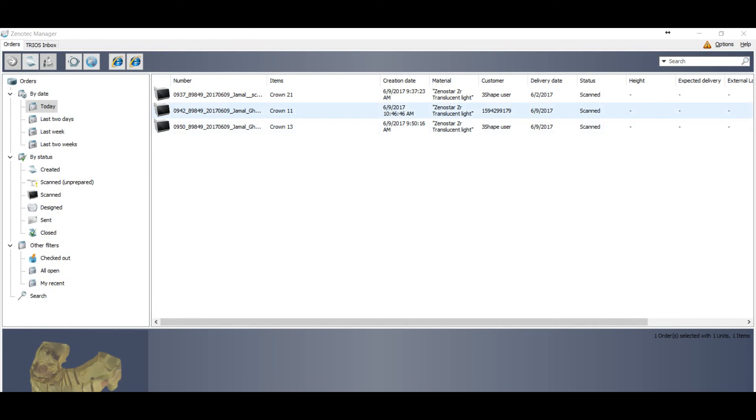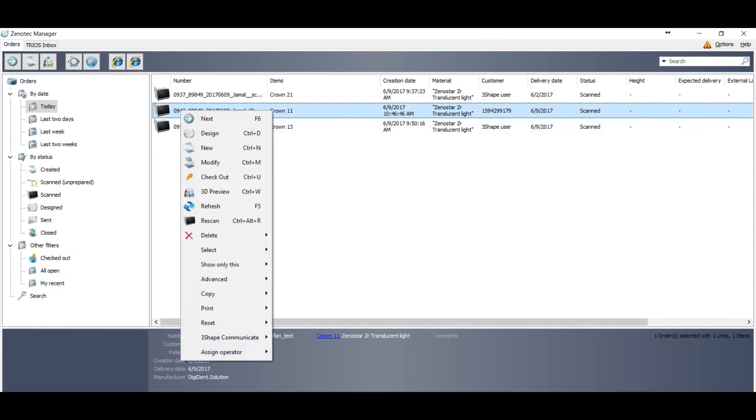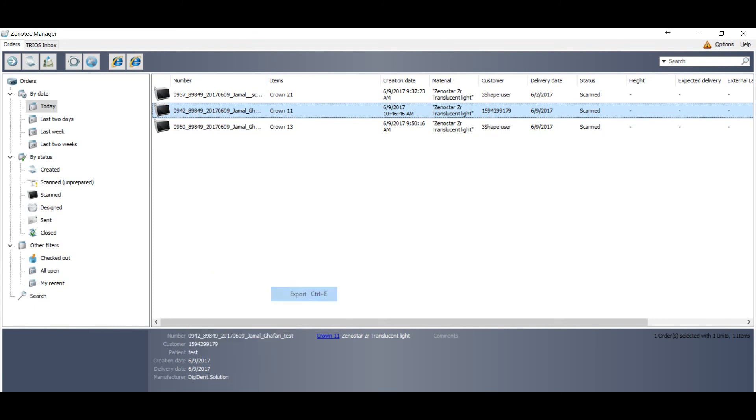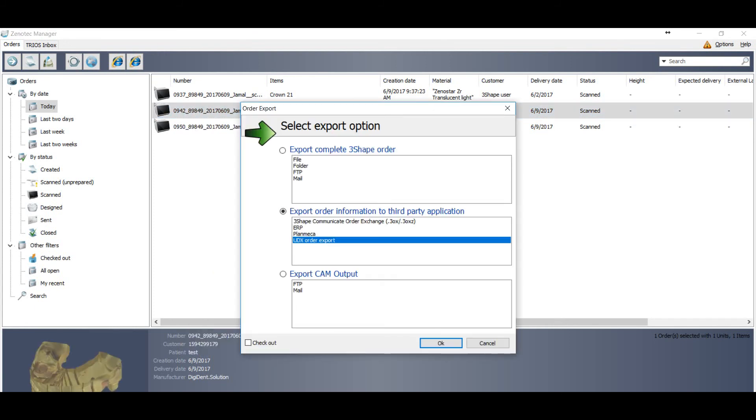And now you can see there is no more yellow mark. So you can use the same way to convert this order into STL. Just go to the advanced, go to the export, and selecting the same option: Export order information to third party application and UDX export, and you are done.